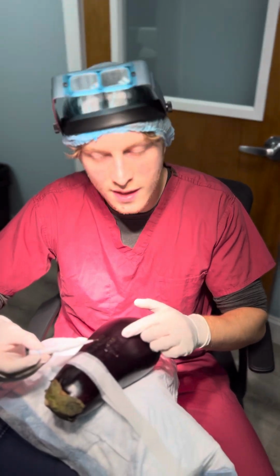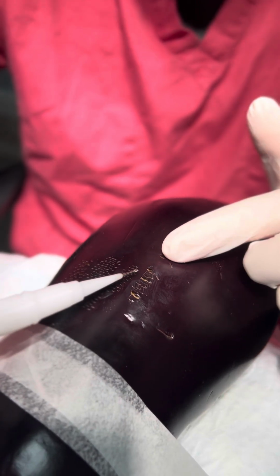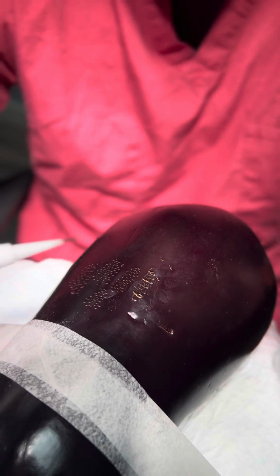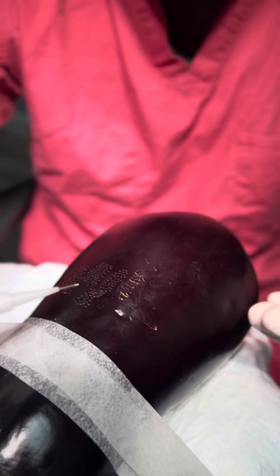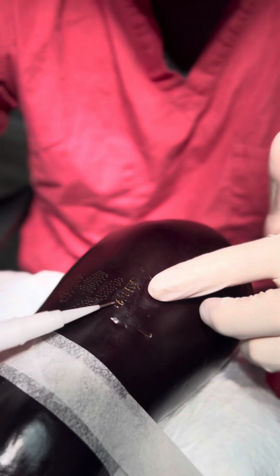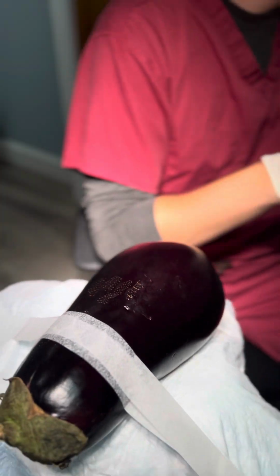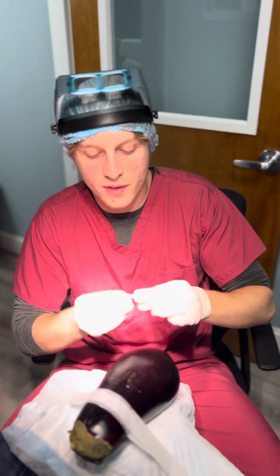If you can see just again here, these are the incisions that we made. If you look at them, some of them are kind of larger than others. They look a little bit messy. Obviously there's going to be variation in how good they look depending on who's using them, but we've used implanter pens before, and these are the kind of incisions that this particular one made. So not so impressive.